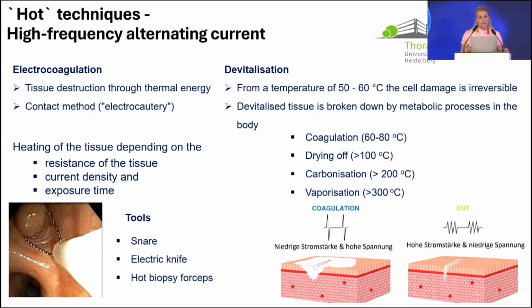Our tools: the snare, a really nice way to cut, especially lipomas or carcinoids. It's a very nice way to remove them. Electric knife or hot biopsy forceps.